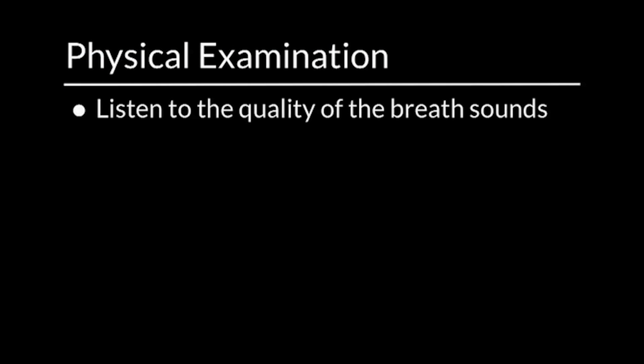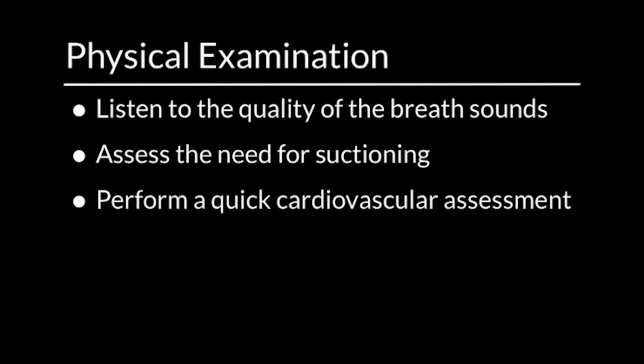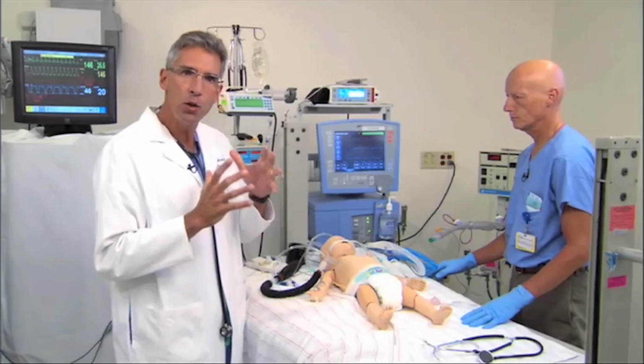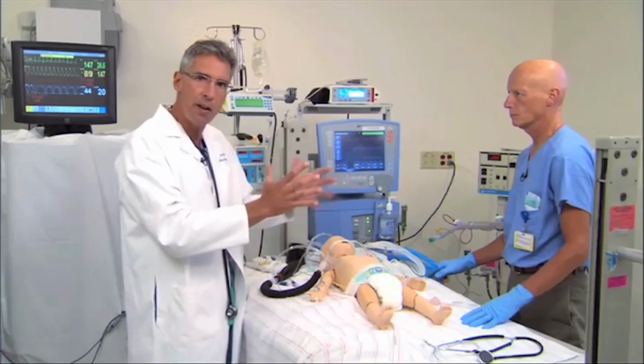Now, in particular, during my physical examination, I want to listen to the quality of the breath sounds during conventional tidal ventilation. Remember, we're going to lose that ability once we transition to high frequency. I want to assess the need for suctioning, and I want to perform a quick cardiovascular assessment. I want to make sure that there's adequate cardiac output. We typically don't monitor cardiac outputs in these patients, so I'm going to monitor peripheral perfusion, capillary refill, because again, there's a potential for introducing some hemodynamic instability when you transition from conventional ventilation to high-frequency oscillatory ventilation.